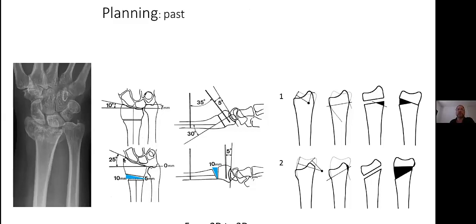If you're good at drawing, you make some plans, and you can measure angles and how much will be missing when you get it to the right position. So you know which defect you will have and how much you want to fill, and you can do the corrections in different ways, and you get a different character of the reconstructed bone.